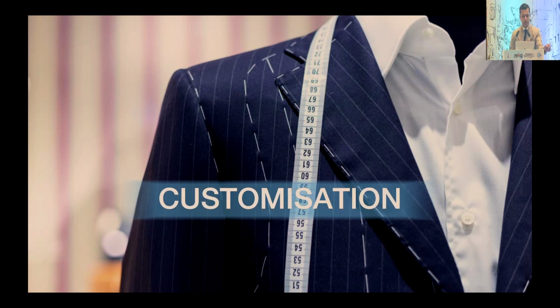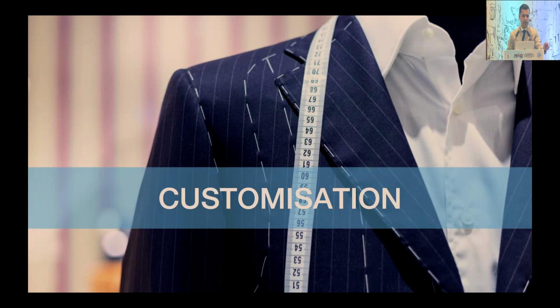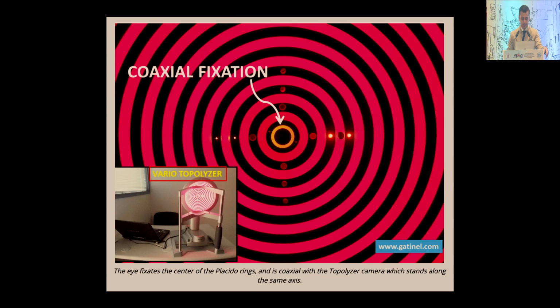And this is true customization, which is, as of now, not available with any lenticule or any other LASIK formats. So obviously not Contour, there are certain companies that also have topo-guided treatments, but such level of customization is still not available with any sort of lenticule extraction.